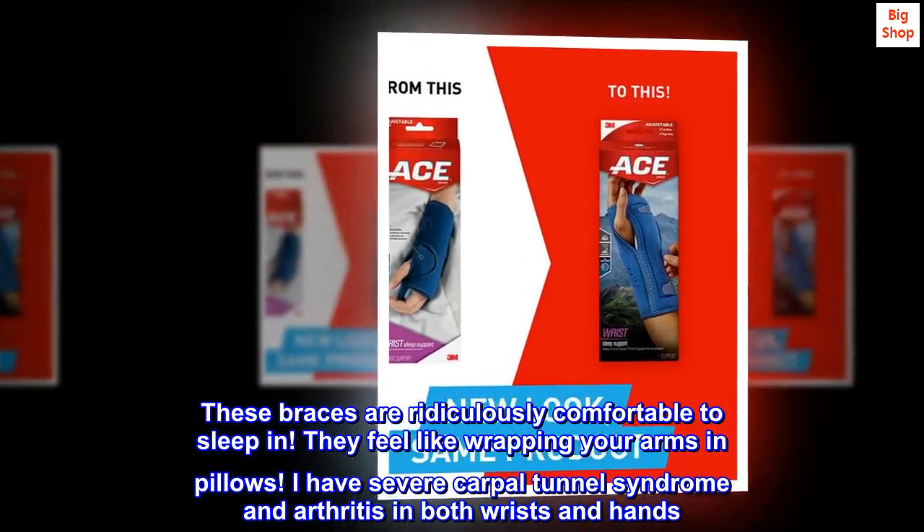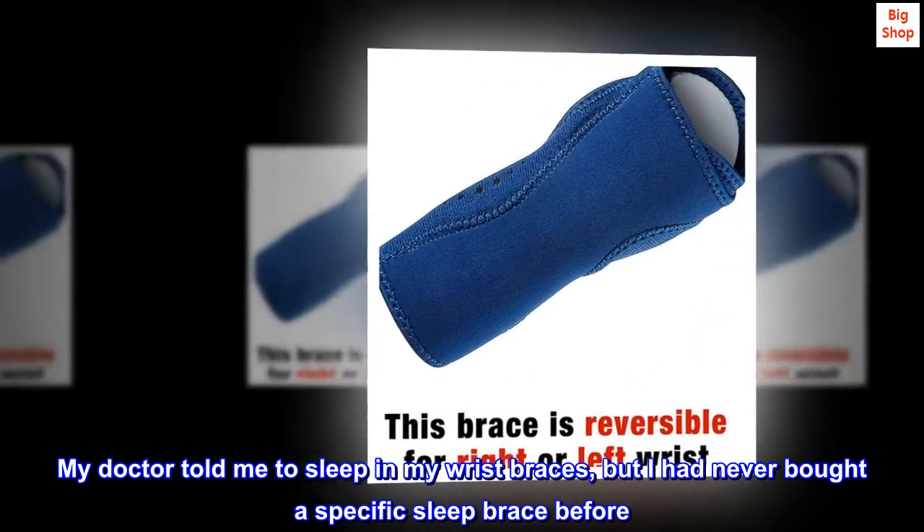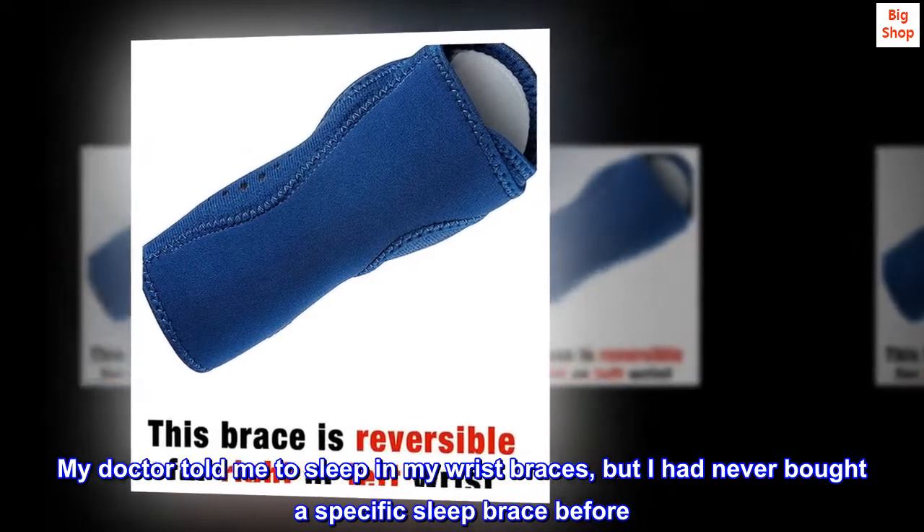I have severe carpal tunnel syndrome and arthritis in both wrists and hands. My doctor told me to sleep in my wrist braces, but I had never bought a specific sleep brace before.